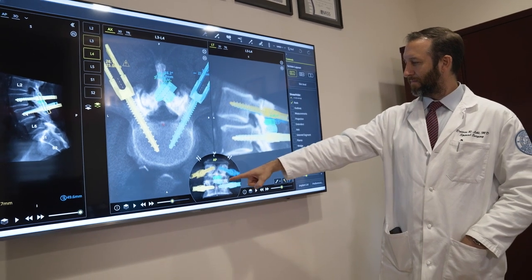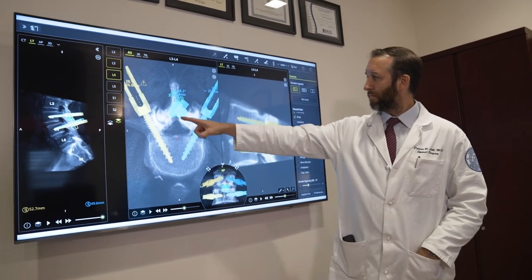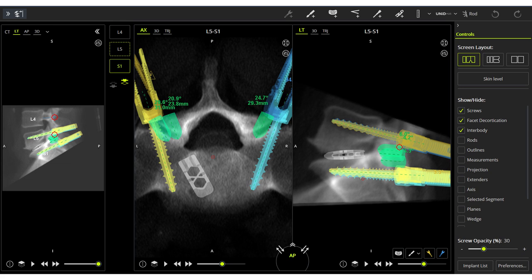Surgical planning software. The software offers a pre-definition of pedicle screw trajectories, decortication of facet joints, and decompression before making the surgical incision. The robotic registration process includes the facet joints and the lamina, allowing for planned decompressions medially to the facet joint, including the lamina.